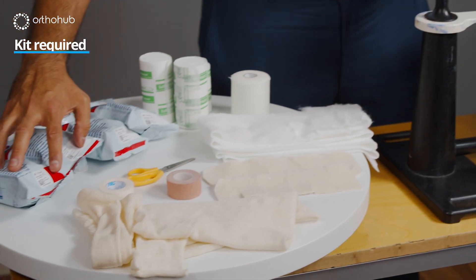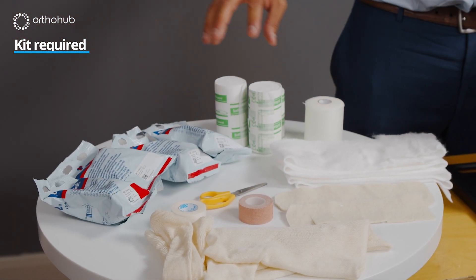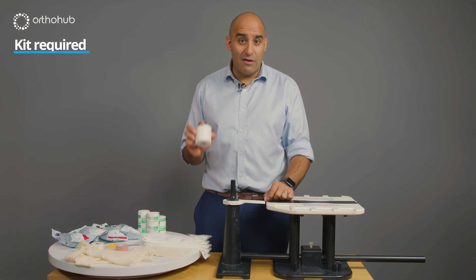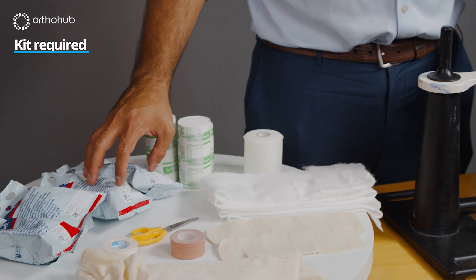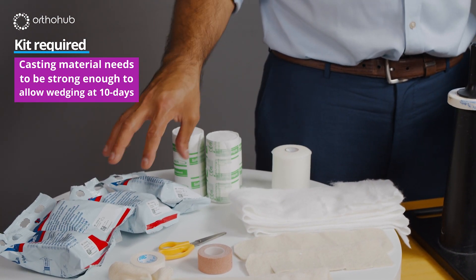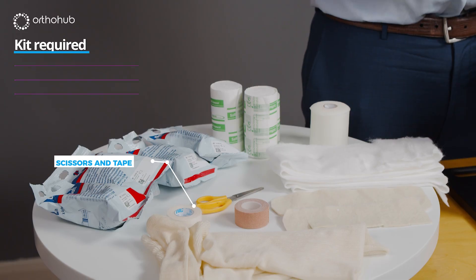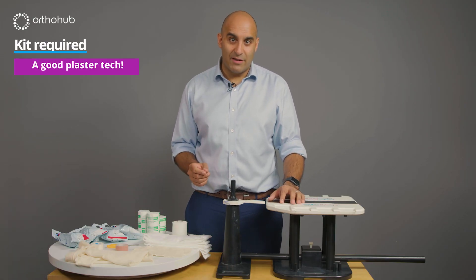We have some scotch cast material — I typically use two inch and three inch for that. We have velband to provide support, and tensor band which helps when covering up the velband before applying the plaster and really aids removal. The reason we use scotch cast is in case we need to do wedging, as it gives the right strength of material. You'll also need inch pink tape, scissors, and most importantly a plaster tech who knows how to apply a hip spiker.